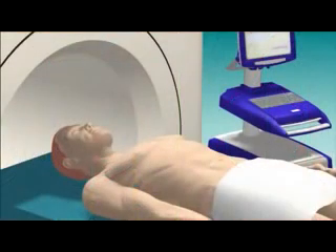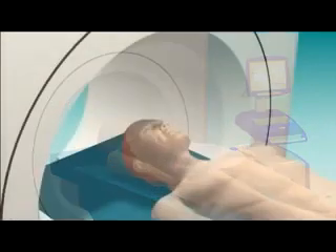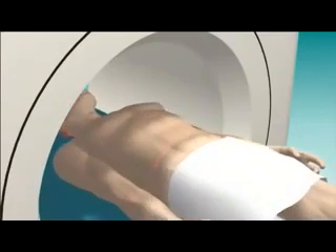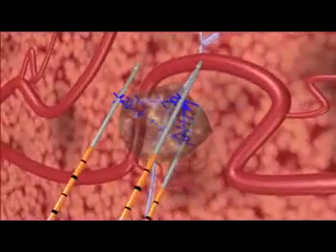The IRE treatment is minimally invasive and is performed under general anesthesia with ultrasound or CT guidance. Preoperative imaging allows precise calculation of the tissue volume and shape to be ablated, and aids the planning of appropriate positioning for the NanoKnife IRE electrodes.